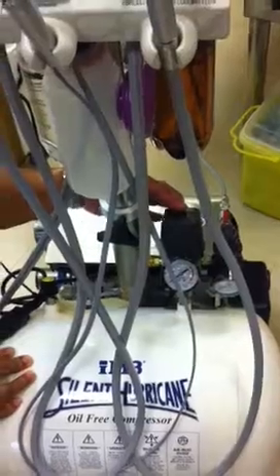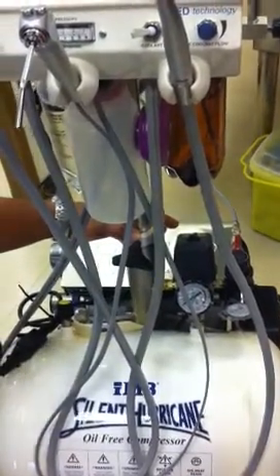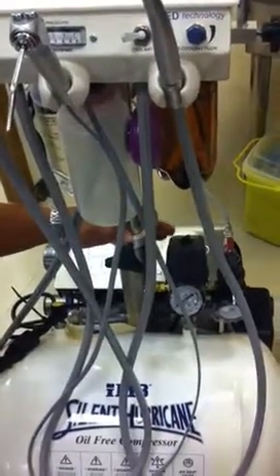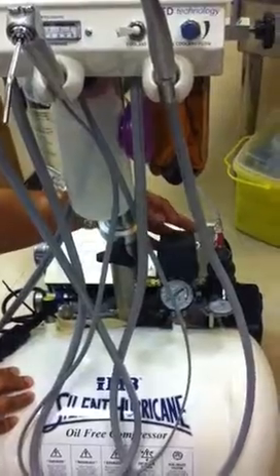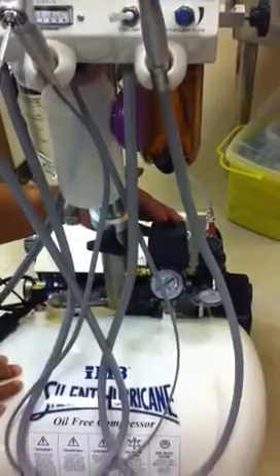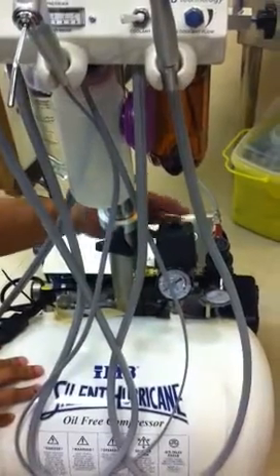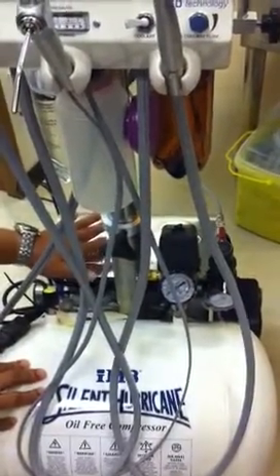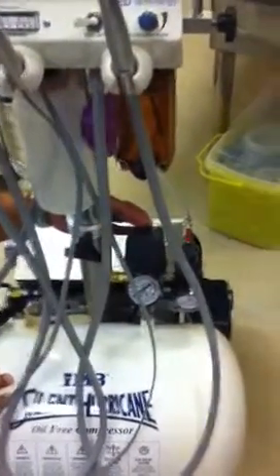Right here, there's this switch. With any CE marked equipment, there is a need to have a safety switch, but sometimes this safety switch can be a pain, because some users may accidentally turn it off and assume that the whole thing is not working. In any case, if you find that the compressor is not kicking in, troubleshooting step one: maybe someone accidentally turned it off.